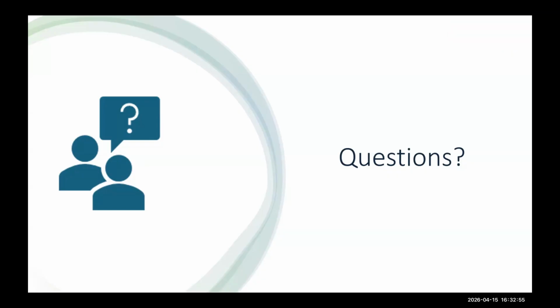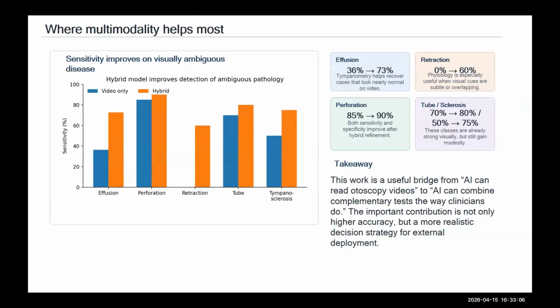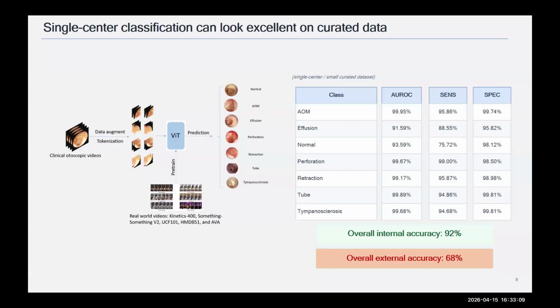So I'd like to go back for a moment to when you were talking early about the data from one center, and then when you tried to expand the perspective to look at data from a second and subsequent center, it sounded as if the accuracy of the results declined. And I was wondering, do you have an idea as to what were the characteristics between the first center that you evaluated and perhaps a second or subsequent one that you think contributed to that low quality of results?